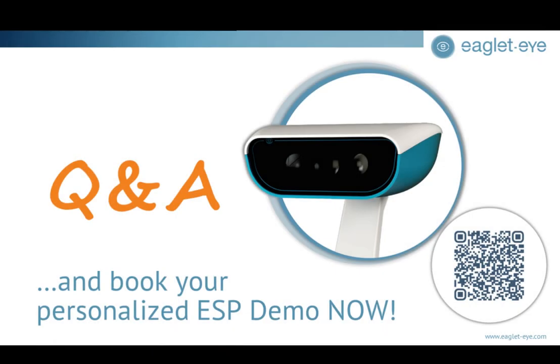Thank you very much, Sheila. That was just terrific. And we do have a couple of questions in the chat area. So one is, dry eye patients have short TBUT. Will it affect the ESP measurement? And the second part of that is, do you use LA to take the ESP measurement?